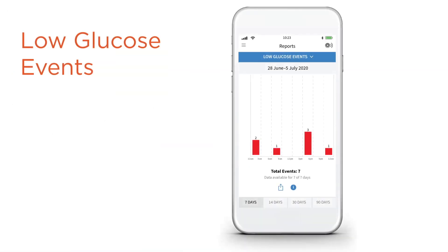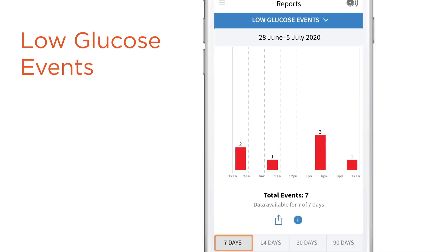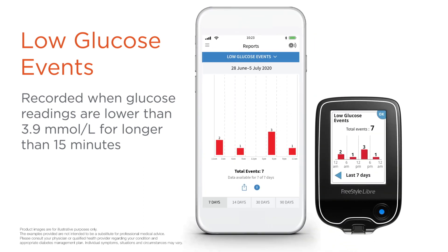The low glucose events report tells you when you've experienced a low glucose event. Let's look at the last seven days. The Freestyle Libre system will record a low glucose event when your glucose readings are lower than 3.9 for longer than 15 minutes. Your total number of low glucose events are displayed in the graph, and the bar graph tells you what time of day they're occurring.